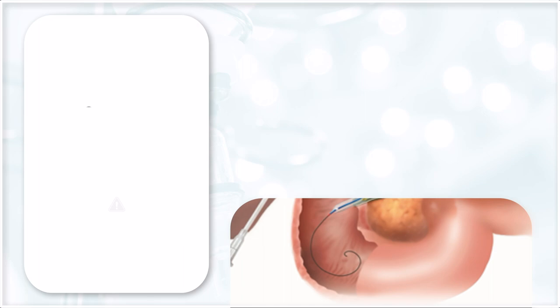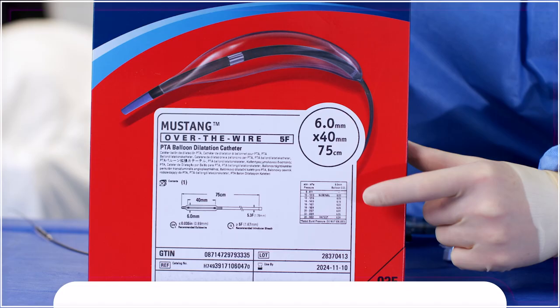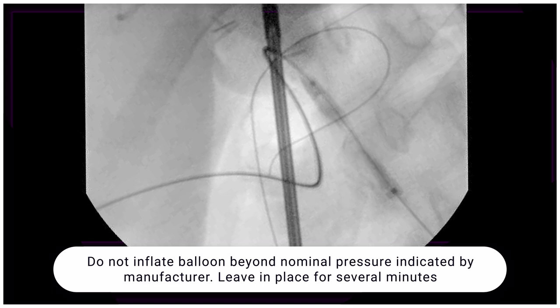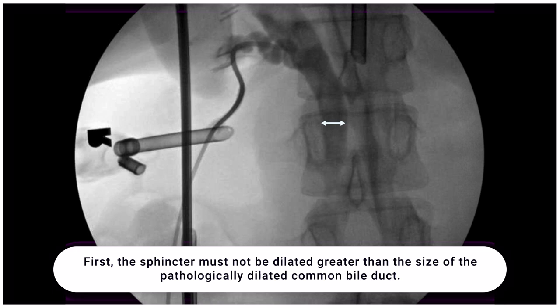Step 8: Bring the balloon up to profile slowly with elimination of the waist. Do not inflate the balloon beyond the rated pressure indicated by the manufacturer. Leave it in place for several minutes — we typically leave it in place for up to three to five minutes. For balloon size, the sphincter must not be dilated greater than the size of the pathologically dilated common bile duct.